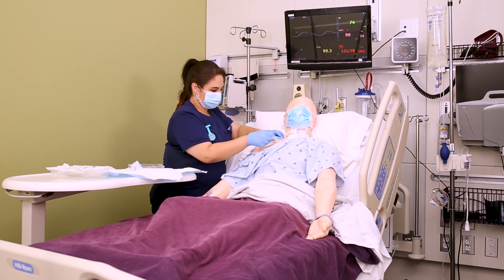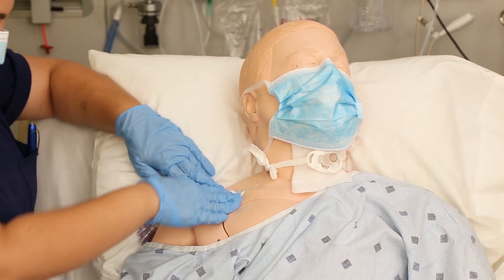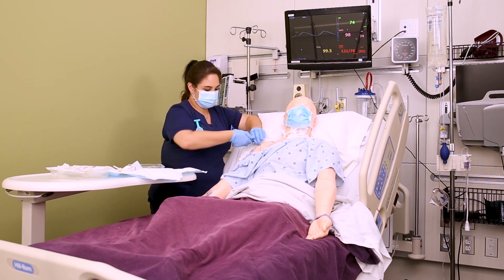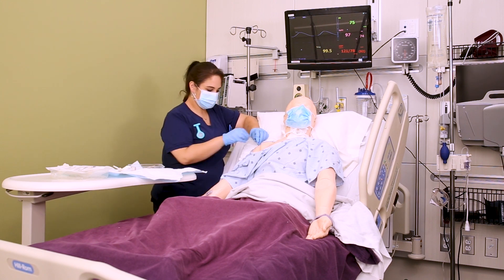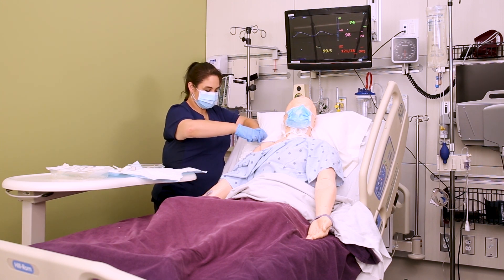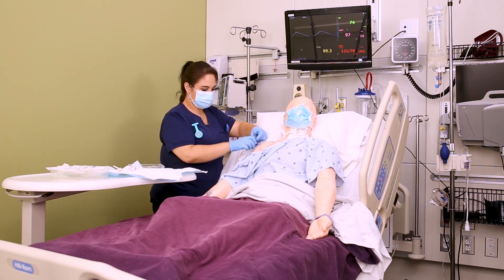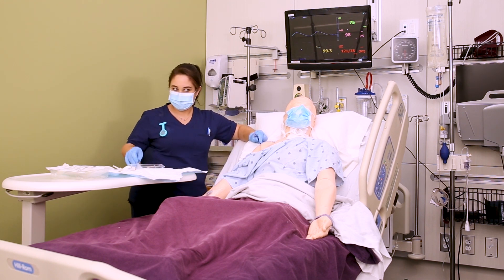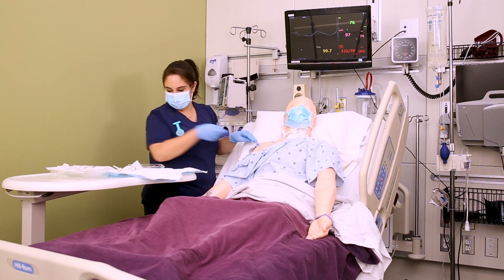Depending on your facility policy, most facilities also require changing the infusion caps when you change the dressing. Make sure the lines are clamped and the new caps are primed with saline before flushing, so you're not flushing small air boluses into the patient. The more air boluses and the larger they are, the greater the risk of an air embolus.